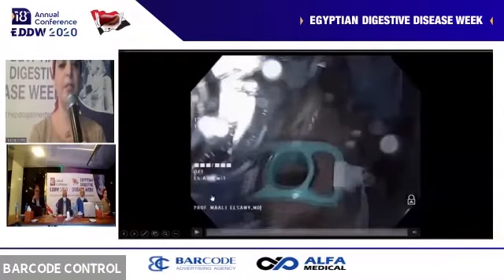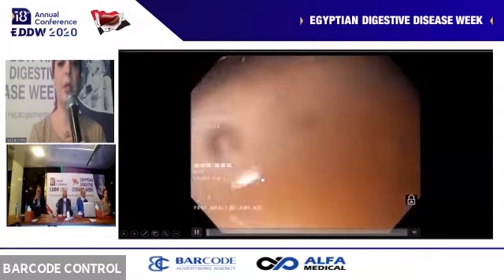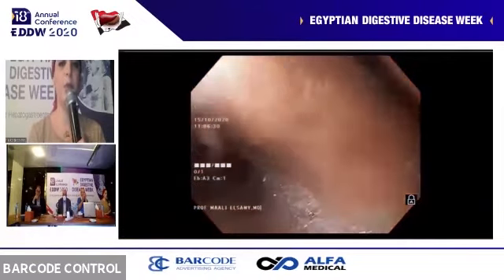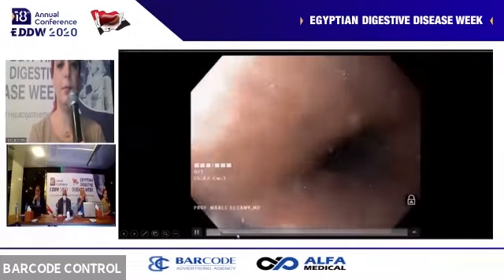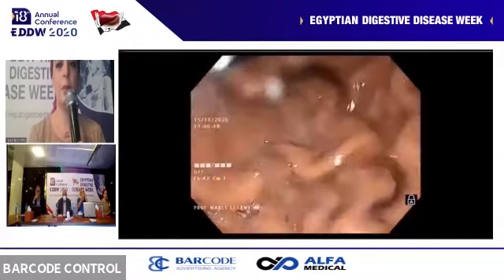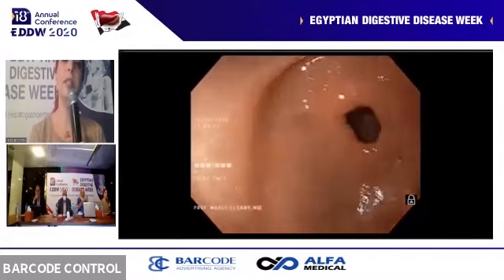This is a video about upper endoscopy. I start by examining the scope outside the patient. Then this is the vocal cords, central. Exploring the antrum.